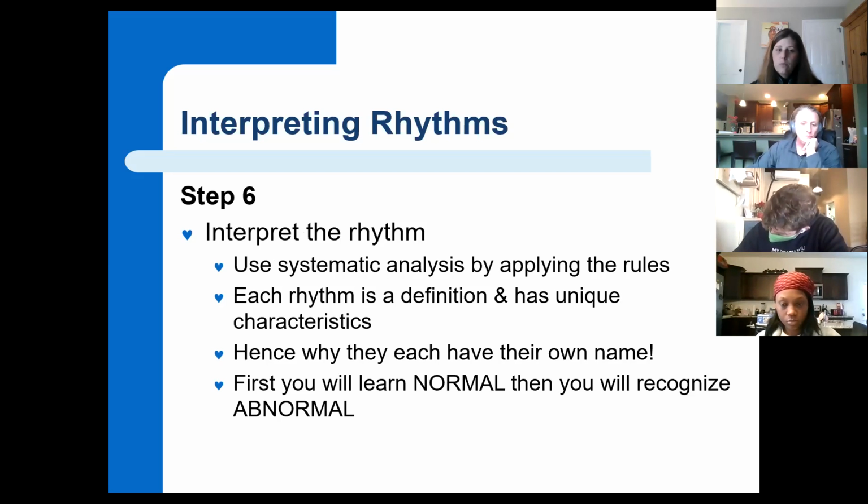So you have to apply the 6 steps. As Dr. Benetti said, if you've been a nurse a long time, we can maybe look at something and we're like, oh yeah, this is that. Sometimes we have to look and go through the steps a little slowly, in our own head too. It doesn't matter how long you've been nursing. But you need to use these 6 steps. And don't skip them. You're too new at this. Don't skip them because you're going to likely choose the wrong response.